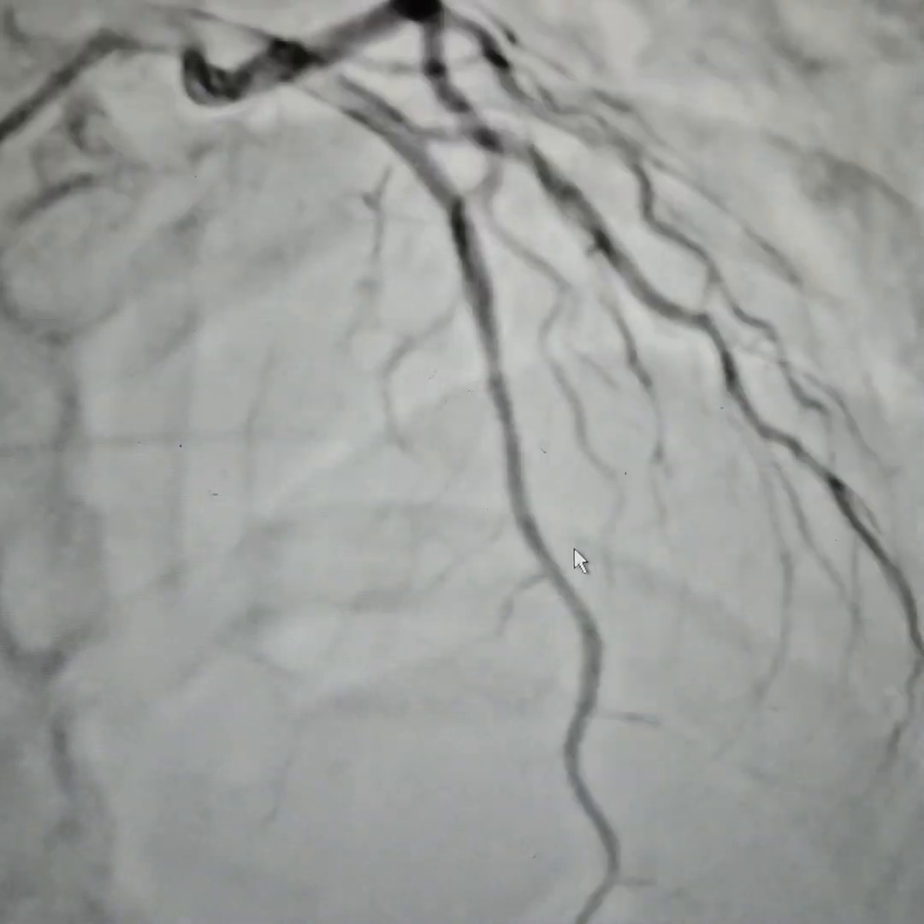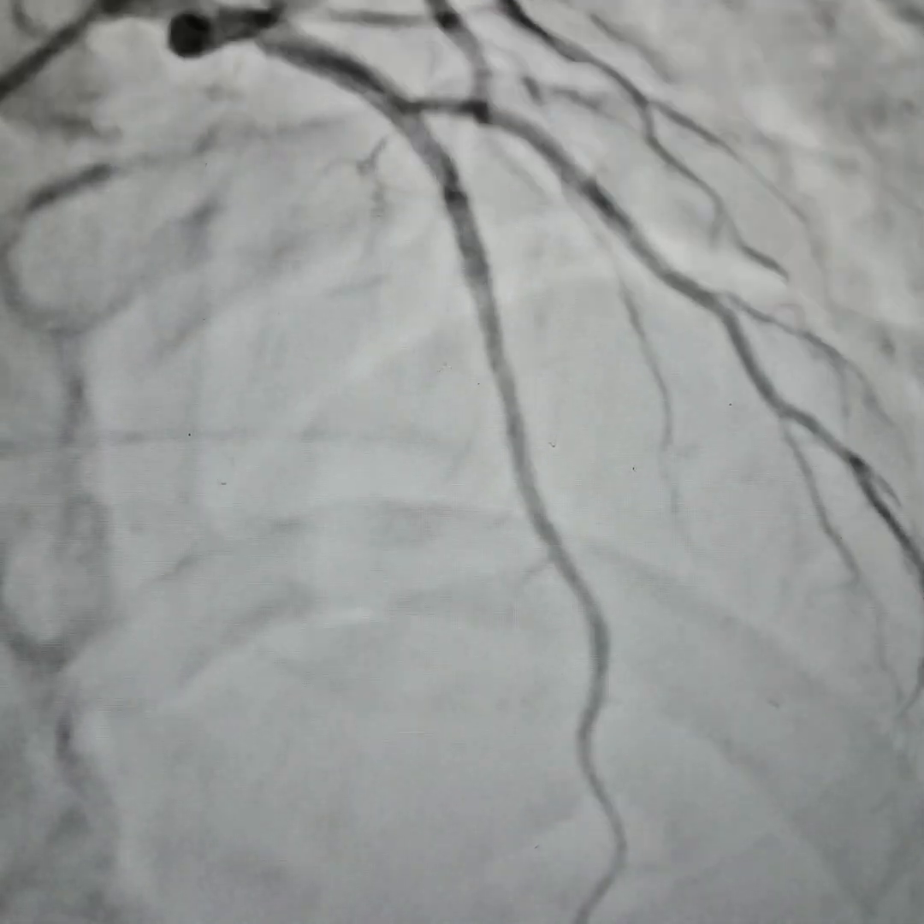Let me show you the before and after. This was the before — you can see a 100% total occlusion. With the use of stent boost technology, this is the final result. Wonderful results.